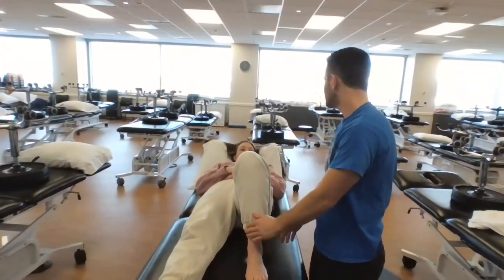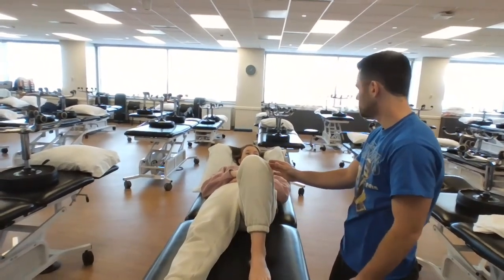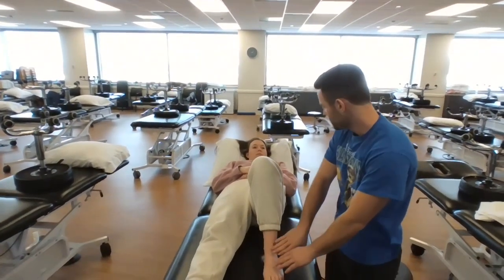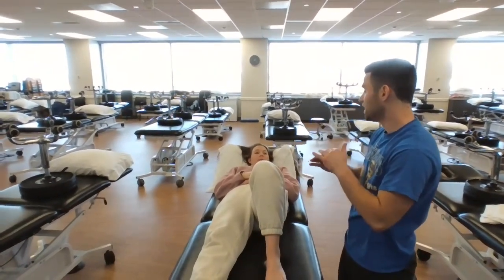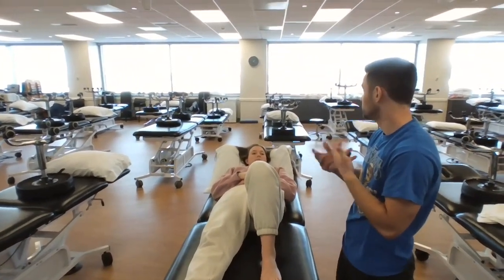Okay, Ronnie, I also understand that you have type 2 diabetes, is that correct? Yeah. Okay. So do you have any type of impaired sensation down here on the foot? No. Can you feel my hand right now on the foot? Yeah. Okay, good, because that's important because this machine may be heating up that ankle, and so I need you to be able to tell me whether or not it's burning so we can change things.